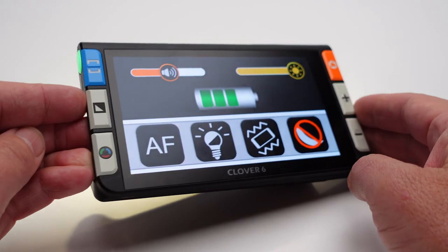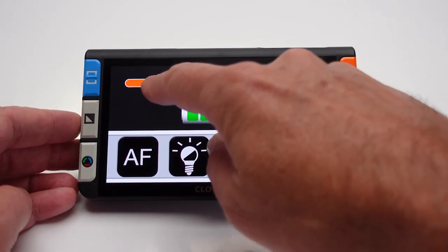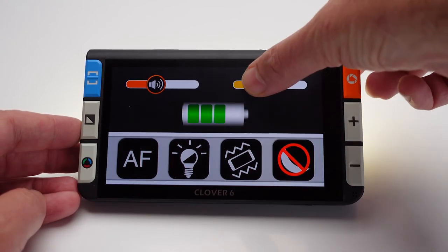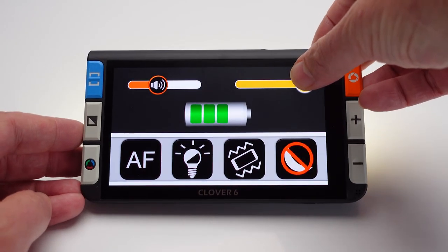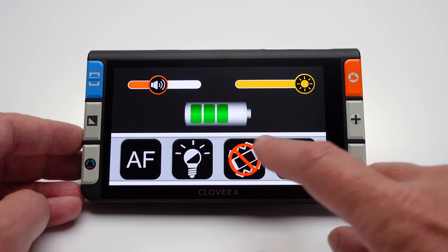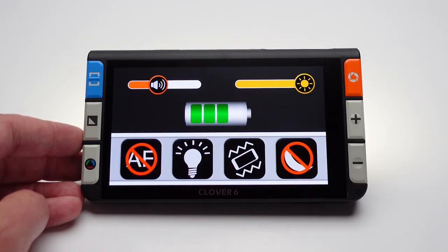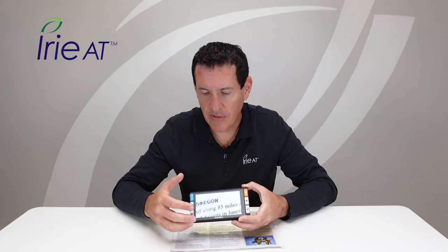If you want to change any settings on the device, just short press the power button — it should be green while it's on. The settings menu will come up and give you a variety of options: you can change the volume of sounds, change the screen brightness, check battery status, turn power saving on and off, turn vibration on and off, adjust the lighting — turn it on and off or brighten and lower it — and change the autofocus. When you're done with this menu, short press the power button again or just wait eight seconds and it will close by itself.